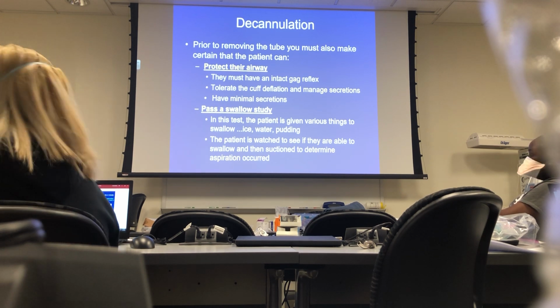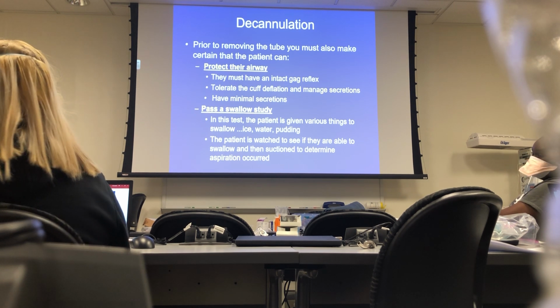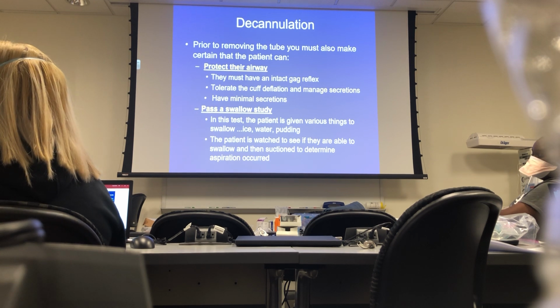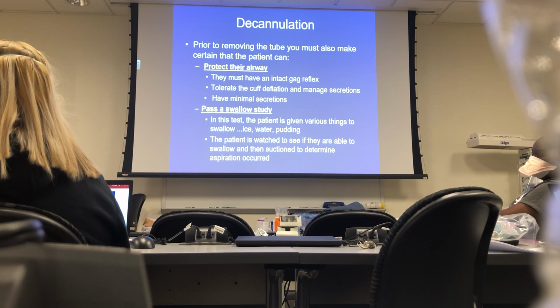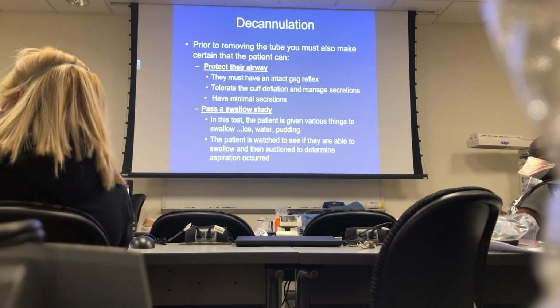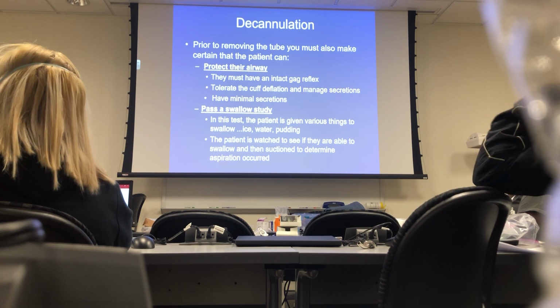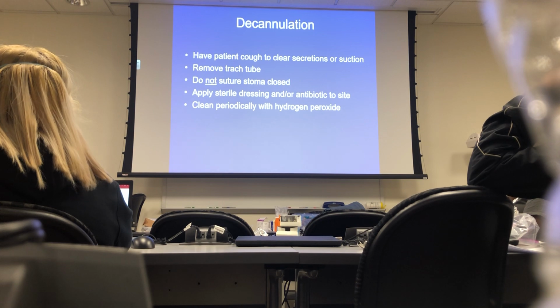When you decannulate, you drop the cuff, you remove the trach, and the stoma does not get stitched closed. You just put a gauze over it, a little antibiotic and gauze. And within 24 hours, that trach will be almost closed. Within 48, it's closed, okay?